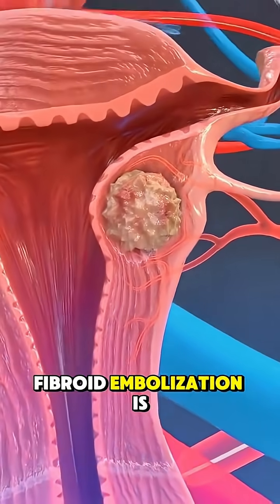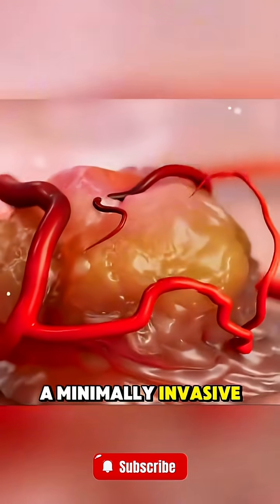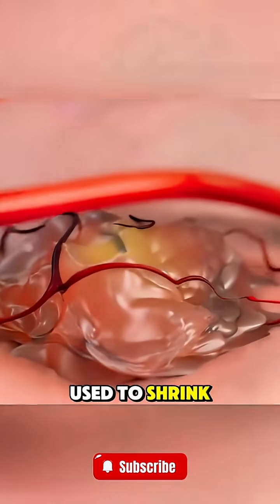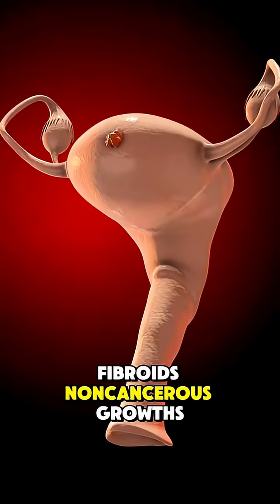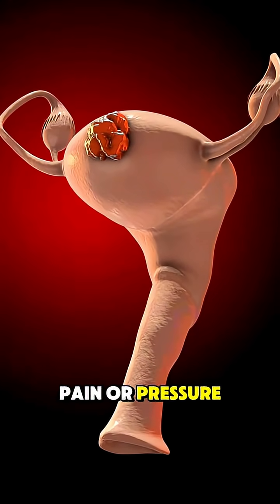Ever wondered how uterine fibroid embolization is performed? Uterine fibroid embolization, or UFE, is a minimally invasive procedure used to shrink fibroids — non-cancerous growths in the uterus that can cause heavy bleeding, pain, or pressure.